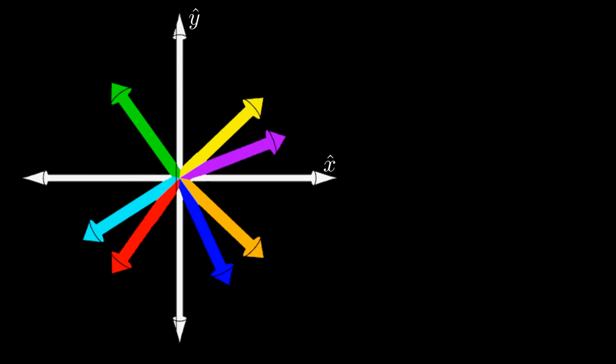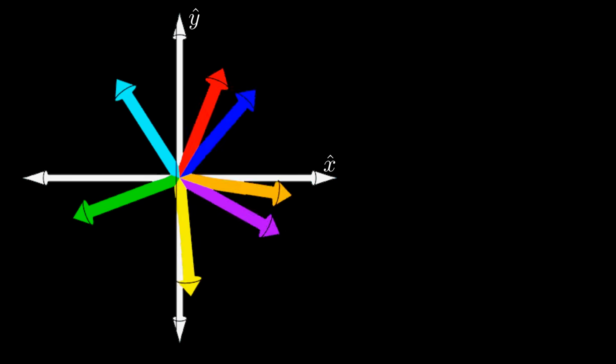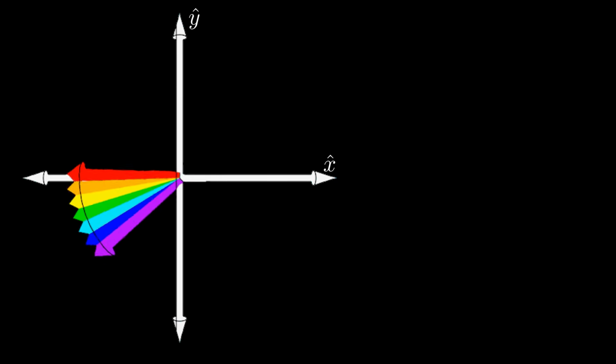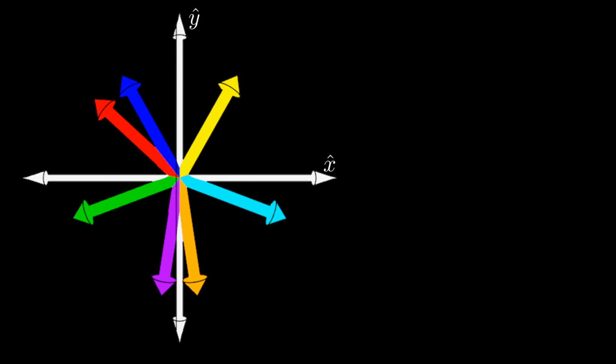His delta B is 0. He's perfectly at Larmor resonance. As such, we know all his buddies will align with him at the echo. We can use this fact to help with our discussion.